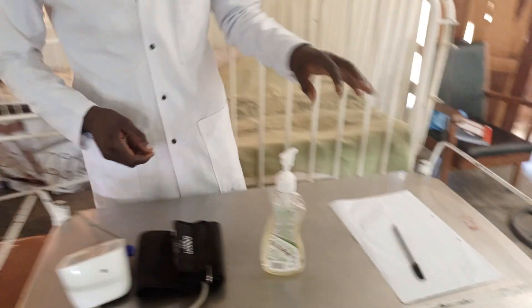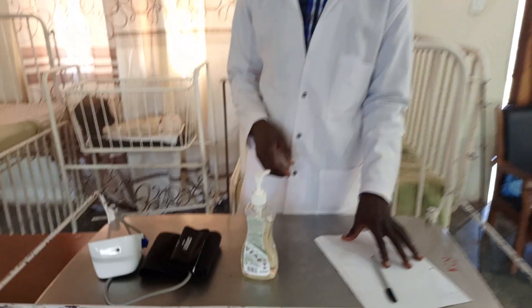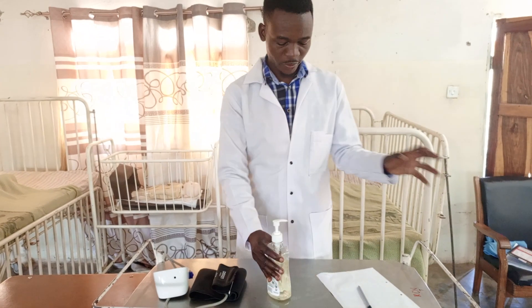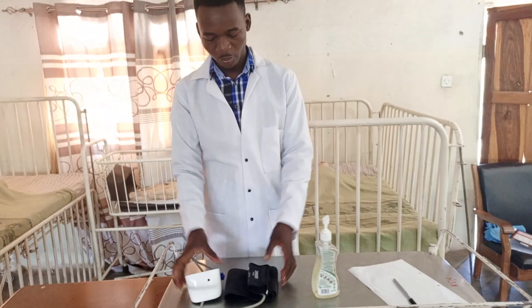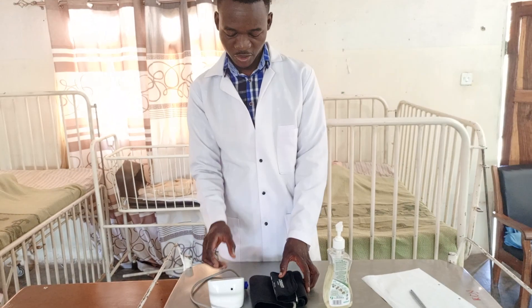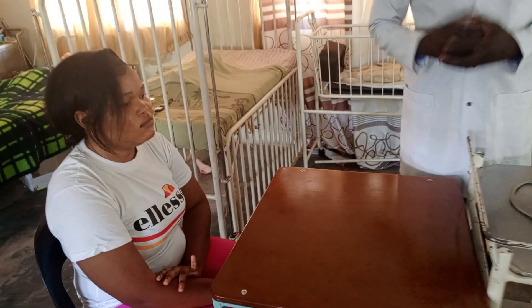We need the paper where we are going to record our findings. We also need the hand sanitizer or water to wash our hands to prevent infection. We also need the BP machine, the automatic one, and the patient we are going to check the BP from.